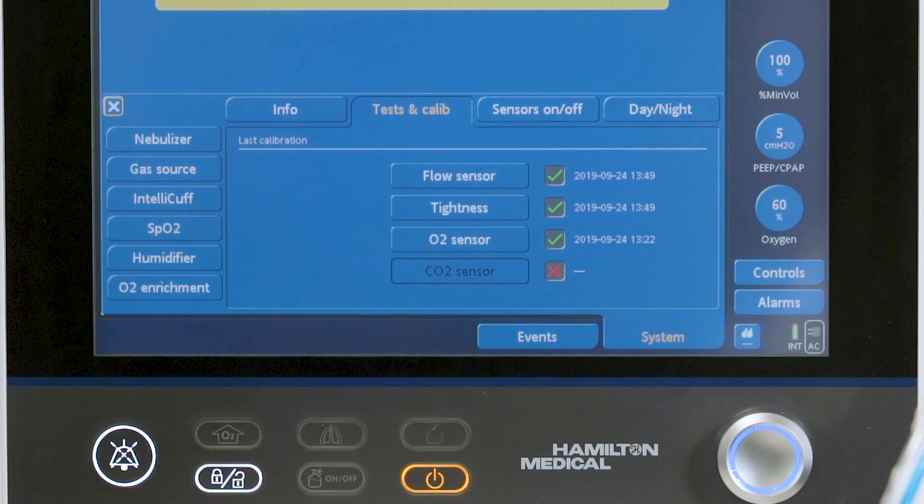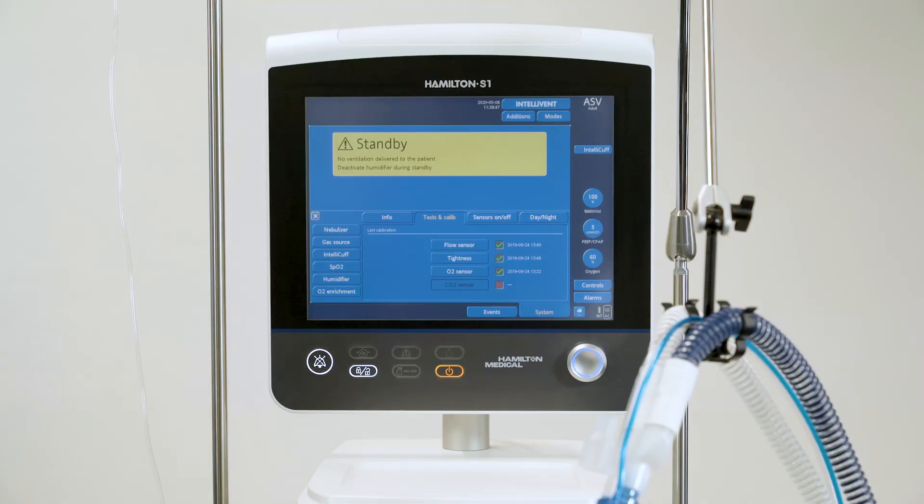If the CO2 sensor is not enabled, the box will be grayed out. Perform a tightness test and flow sensor calibration each time you have connected a new breathing circuit or component, including a flow sensor.